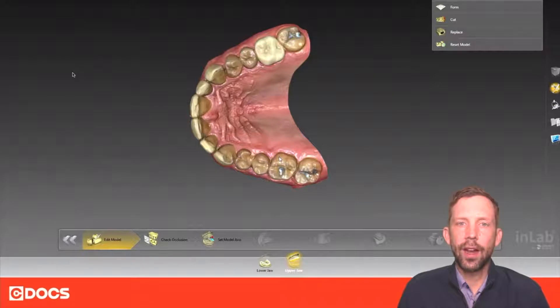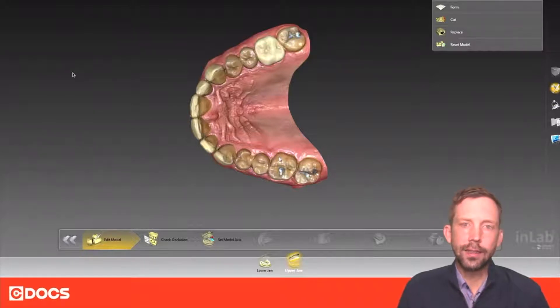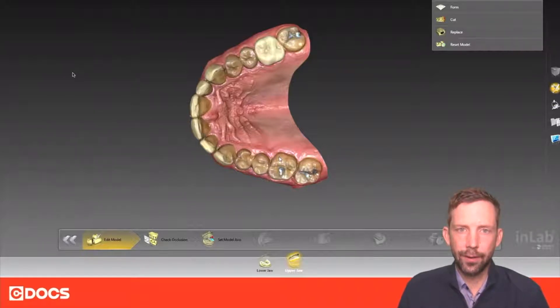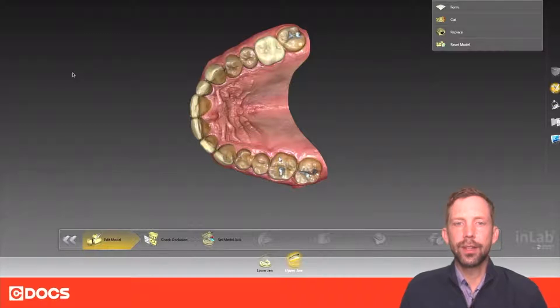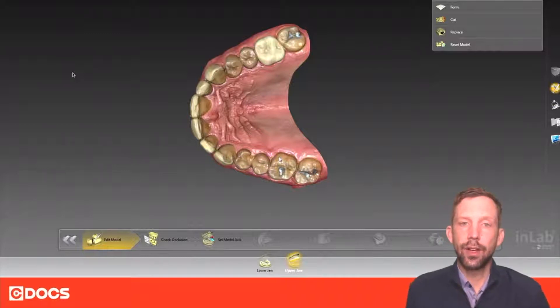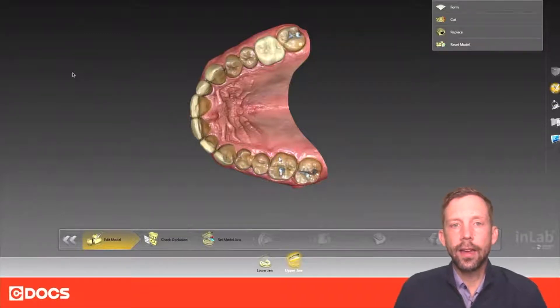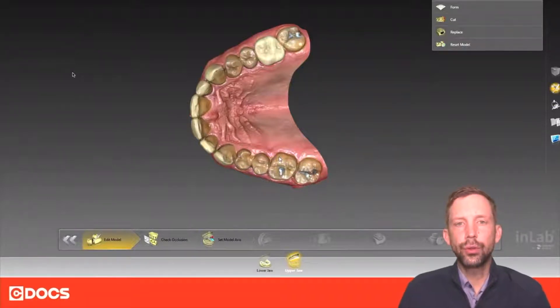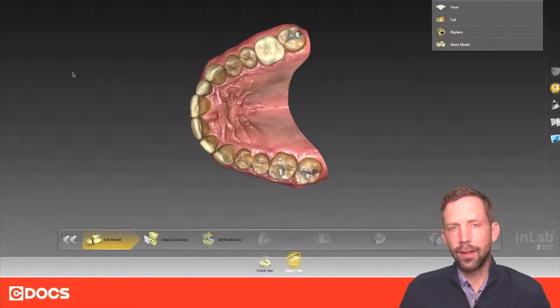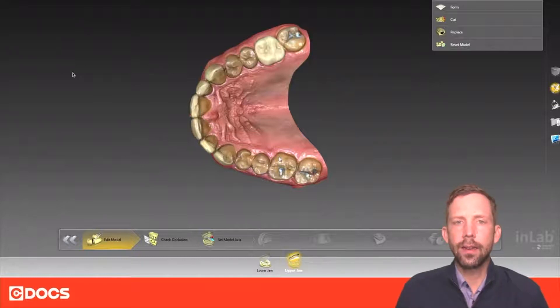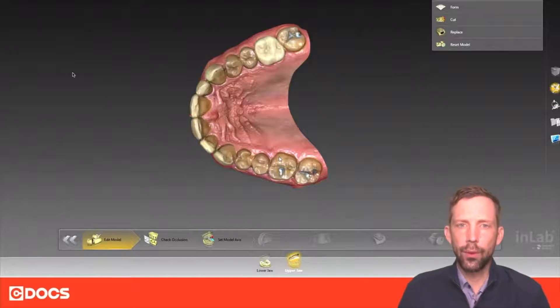The best software that I've personally seen so far is the InLab20 Model Maker. InLab20 Model Maker is an application of InLab20 CAD and it allows you to make models in a very easy way with more of a step-by-step process.